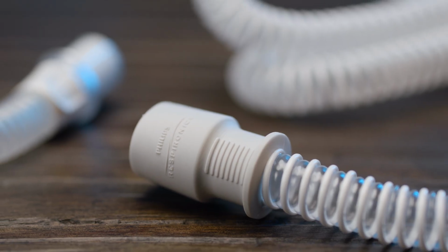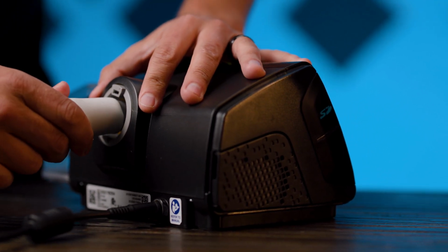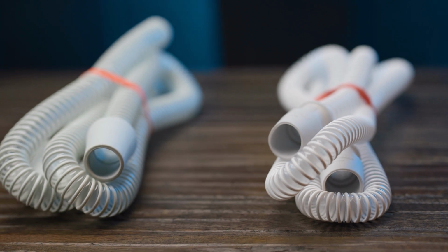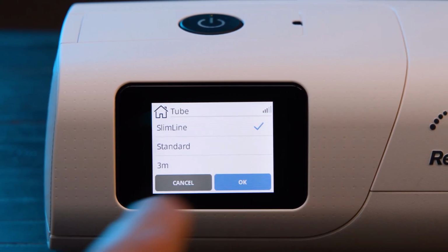Now, all of these have the same connection points at the end, so will be compatible with all of the same devices. The difference is that the skinnier tubes are less heavy, so they can put less drag onto your mask, but a slimmer tube also means that the air pressure is affected. Fortunately, most modern CPAPs allow you to select the size of tubing you're using in the menu, and the machine will then automatically compensate for the change in required pressure. The final decision to make is about the length of the tube.